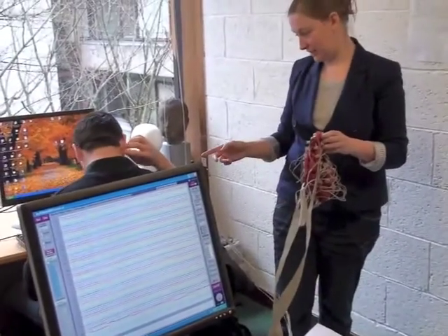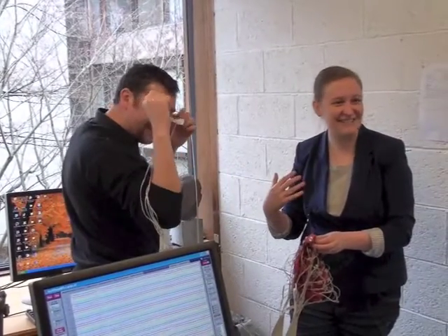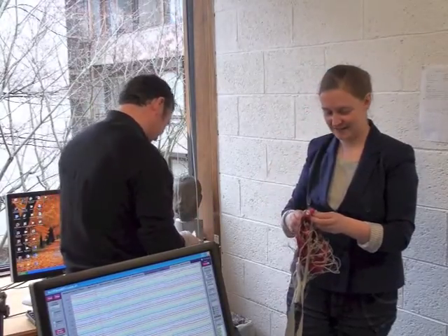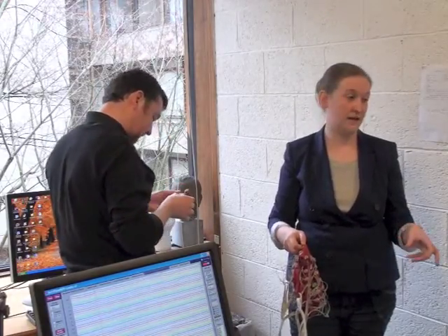As soon as you're okay with that, I'm going to show you how to take out the equipment. People love this. Yes! Horrible. Get out of here! I know, you have one of the double-sided sticky things under your right eye. Okay, so cleaning these, you need to clean it quite quickly after a participant comes.